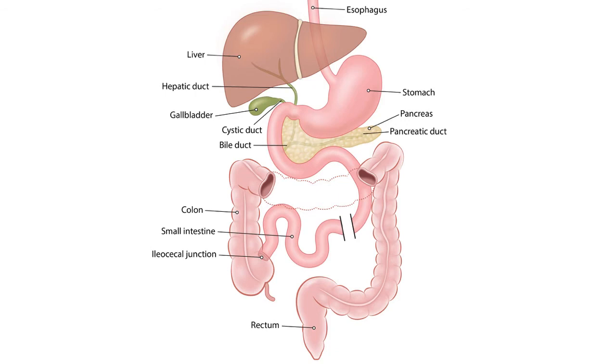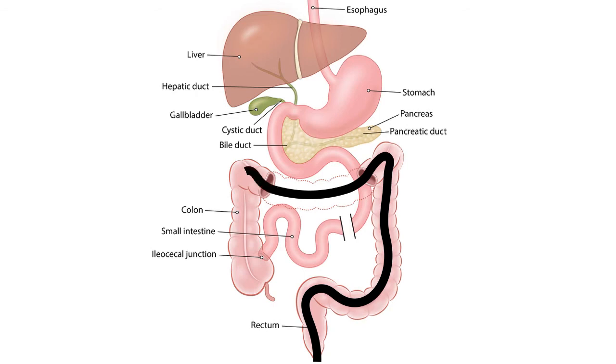It goes up the anal canal through the rectum, sigmoid colon, descending colon, splenic flexure, transverse colon, hepatic flexure, ascending colon, cecum. That is where the opening of the appendix is and also the opening of the small intestine, or the ileum, is. With the colonoscope, you can also enter the ileum. So, you can see a lot of stuff in the colon and also treat any problems in the colon.